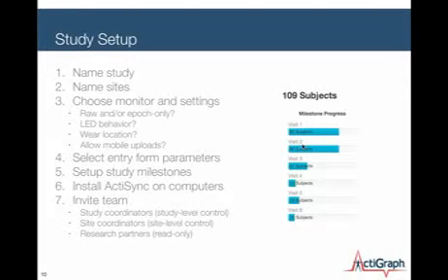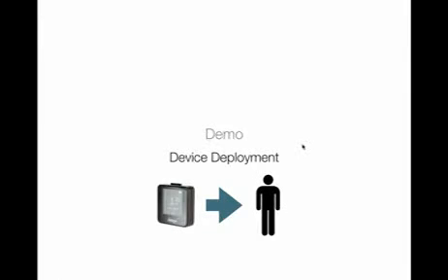And then research partners, if you've got some partners that you're working with, you want to expose that data, you can do that in a read-only fashion to them. So we go ahead and set those folks up for you, and then you can begin data collection. And so very easy. This is a less than an hour configuration for us, and then you're off and running.